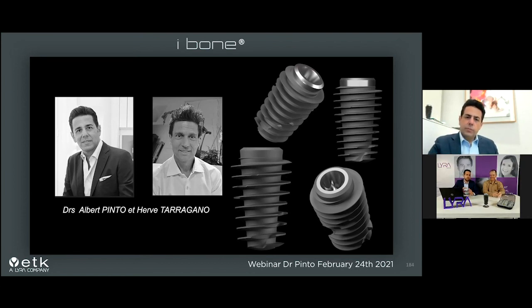Frédéric Lancieux has been reviewing different things, and it is really important that you use the original parts that ETK is manufacturing in France for the prosthetics. I'm going to answer one from Mr. Kevin Pear. So yes, for sure, the prosthetic parts of Natural Plus and Naturactis are compatible with these iBone implants.